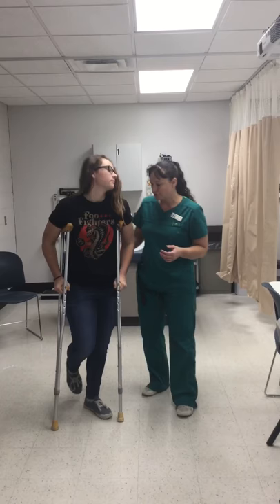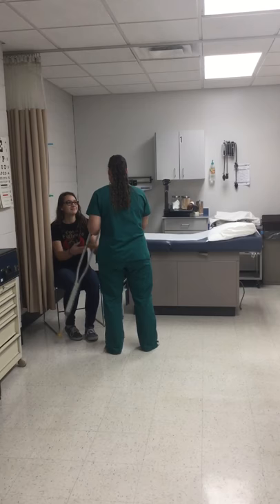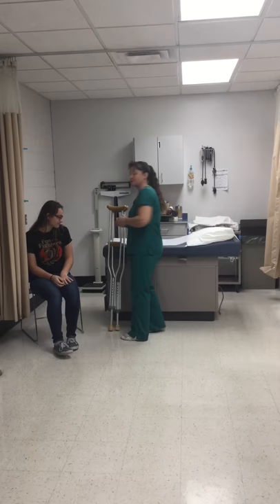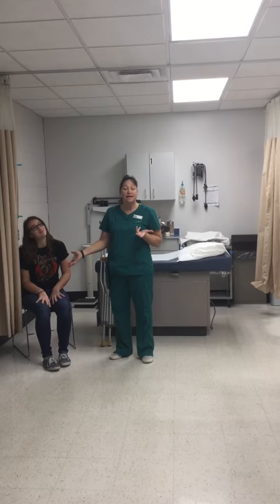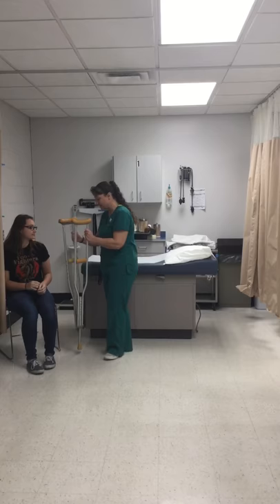Alright Erin, we're going to turn around and I'm going to have you go back to your seat. Doing good. Alright, go ahead and sit, Erin. I'm going to set these aside for a second and ask my patient if they have any questions about what they did, give them feedback on my observation of them using the crutches. So Erin, does that feel comfortable? Do you think this will be better than hopping around? Sounds good. You can go ahead — I'm going to give you these crutches now that you know how to use them, and you are done with the doctor for today.